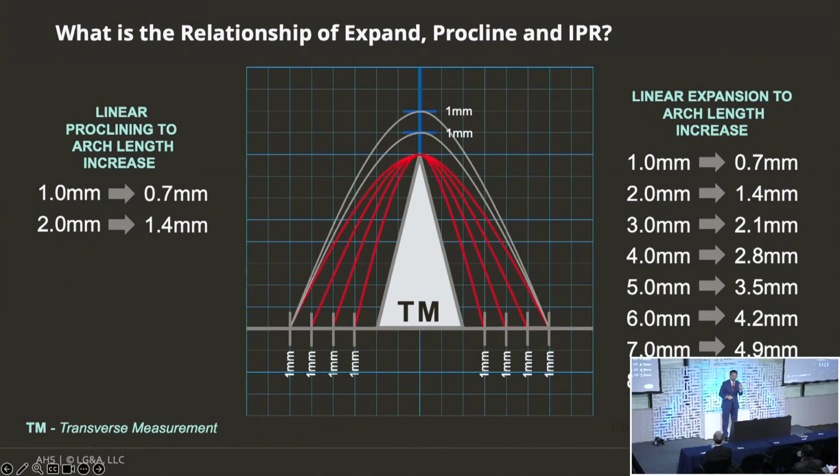Look at your perio probe to remind yourself what 2.5 millimeters is. It's nothing when you're talking about uprighting molars. You can have 2.5 and 2.5 on almost any amount of crowded case you see. You'll easily have this. Wait a second, I just lost 3.5 millimeters of IPR because I just committed to moving my back teeth 2.5 millimeters each way. 2.5 and 2.5, that's 5. You separated the teeth by 5, but it's not exactly 5 millimeters of expansion. It's 2.5 millimeters of uprighting on each side. We only are talking about the back teeth. We haven't even touched proclining the front.